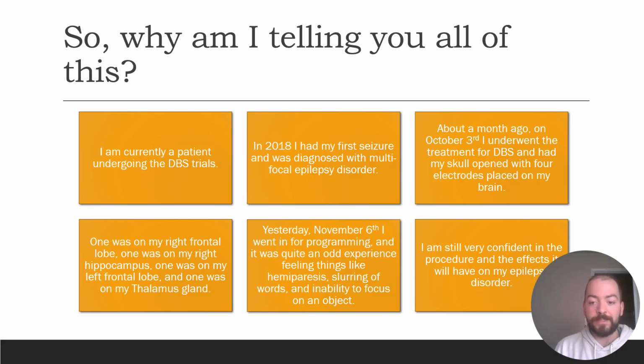They scaled it back down, and essentially through the programming, it'll continue to get better. I'll get more used to the shocks in my brain, and the stasis will stay the same, or not stay, it will change over time. And it also included a bit of slurring of my words, inability to focus on an object. I was looking from person to person, to my mom. My left eye slipped down a little bit, all kinds of different things. And once we finished up, I felt like a normal person. It's just now I have shocks going to different parts of my brain, keeping it in a new place, essentially.